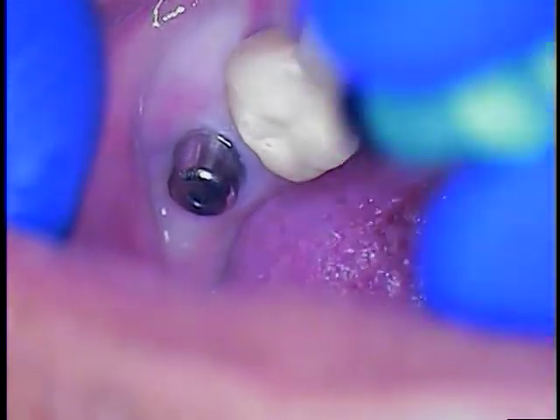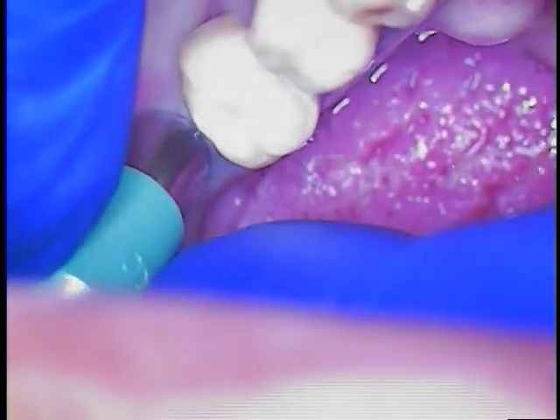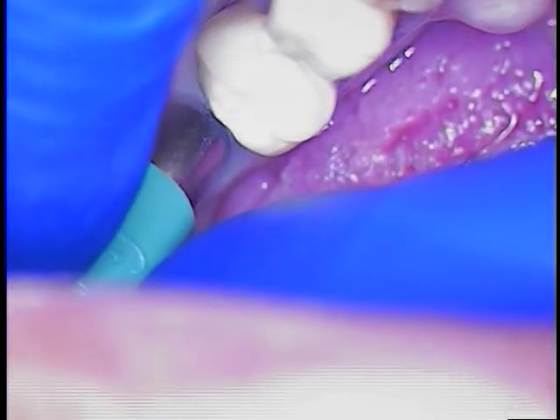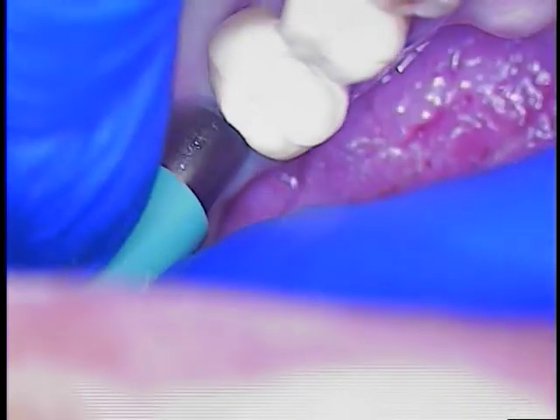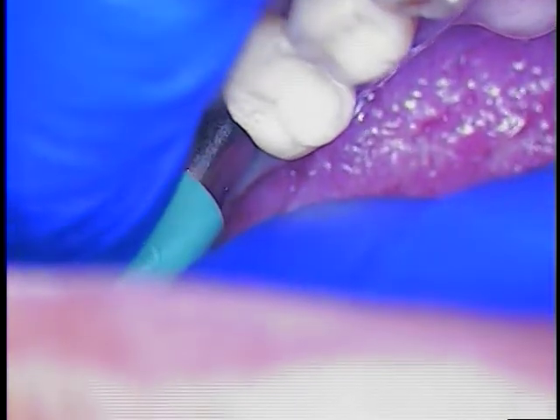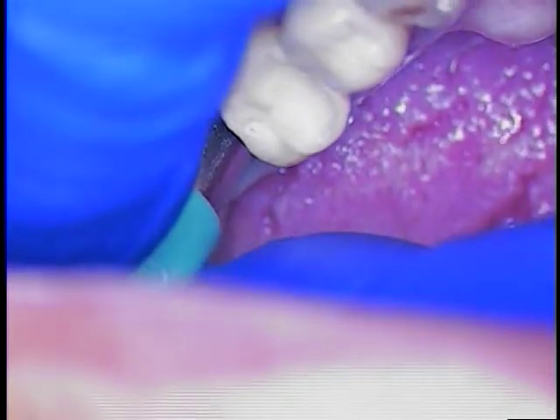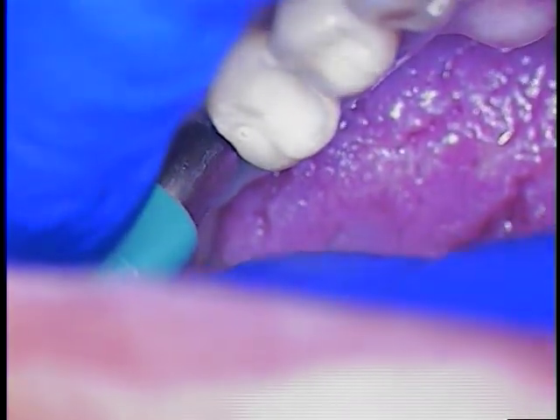We're back with the punch on this external hex rescue case. I'm lining that up slowly, and we don't have x-ray vision, so we're just going to start the punch and rotate it slowly back and forth, and then maybe turn it a little bit more. I'm kind of feeling the rim of the implant.